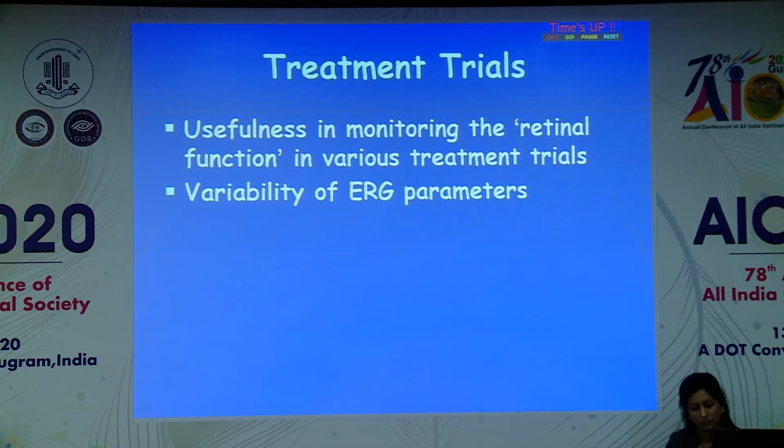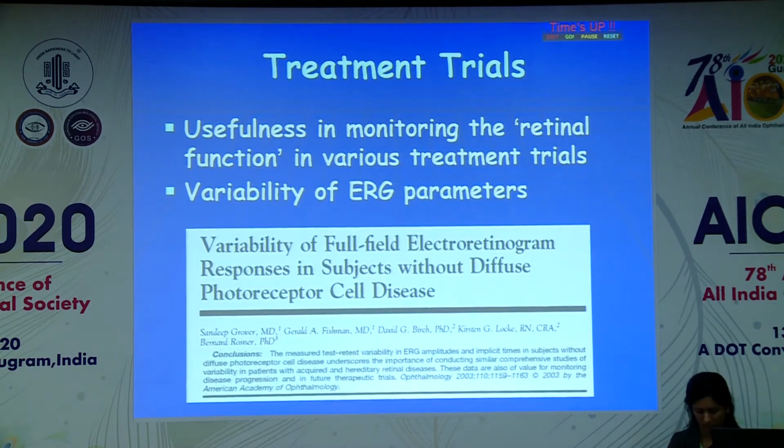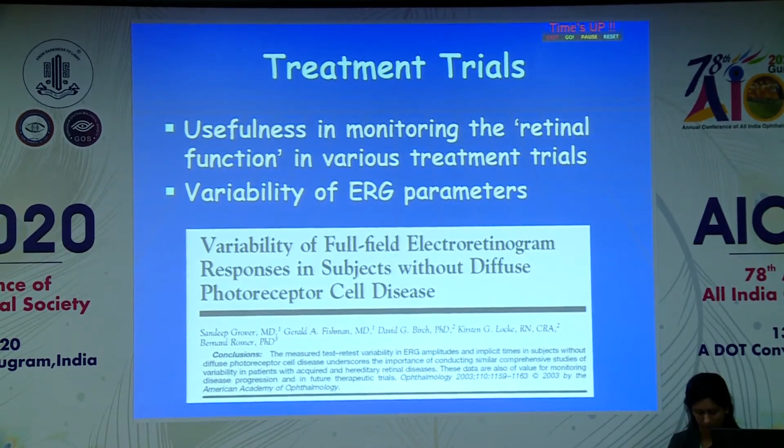And lastly, for treatment trials, it is very necessary to have ERGs for monitoring, although there is a lot of variability of full field ERG in patients. So we have to be very careful how we interpret those results.